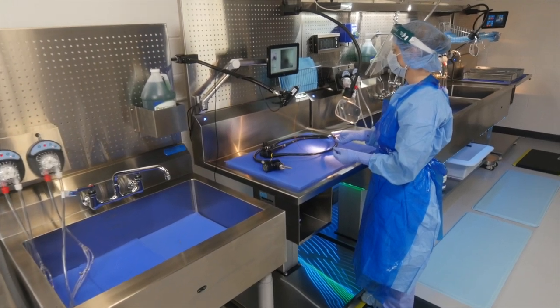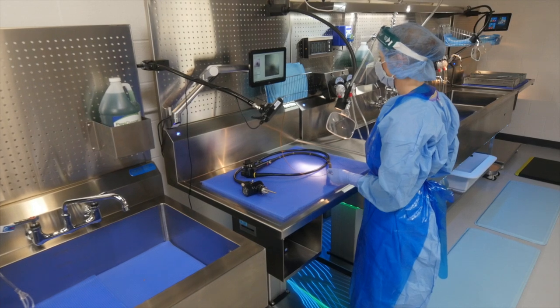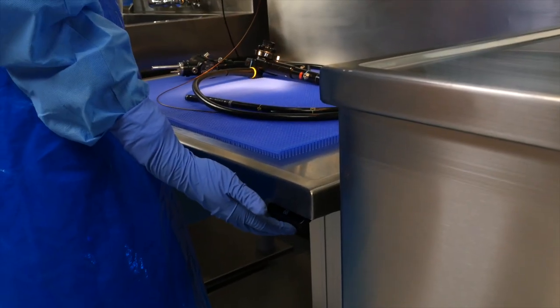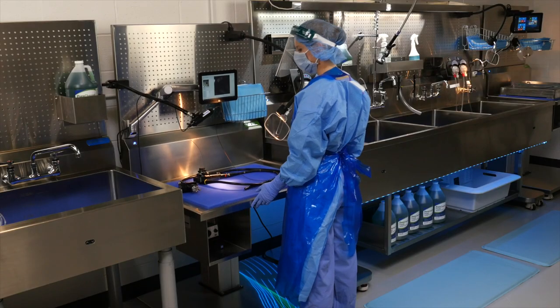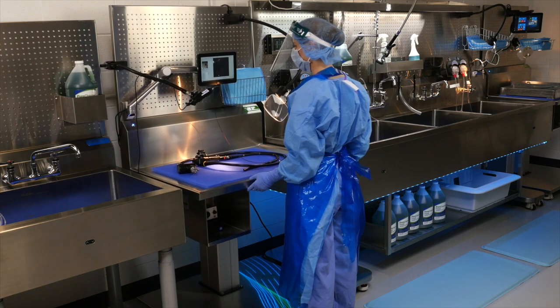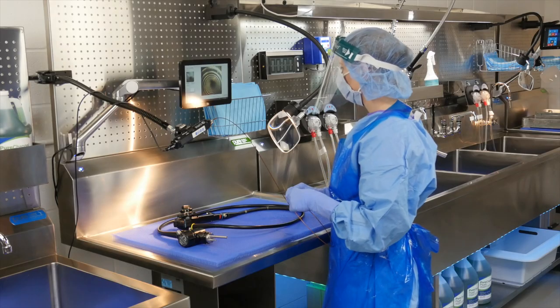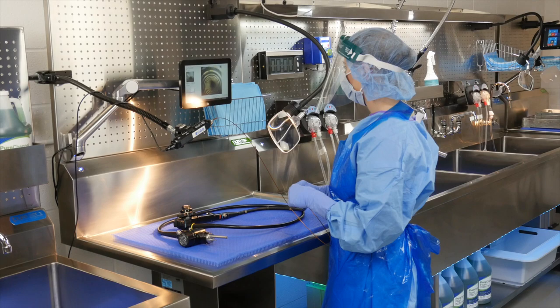PureClear Inspection boroscopes are available in multiple diameters and lengths to accommodate requirements of numerous scopes. Lighting and ergonomics play a large role in the inspection of rigid and flexible scopes. The PureClear visualization station is a height-adjustable worktable that creates a dedicated space for inspection procedures.